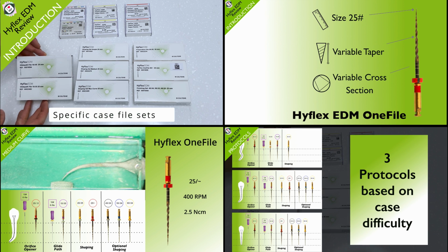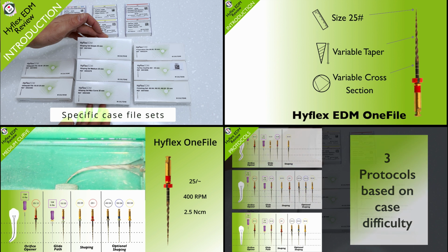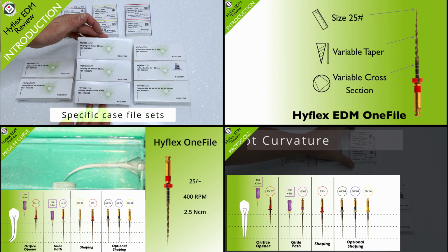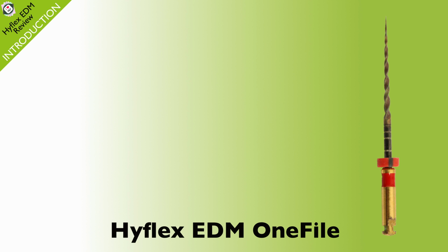Finally, as a bonus, I want to show you why I think this file system might be an ideal endodontic file to use when carrying out NHS treatments, mainly for cost effectiveness. So the file has a few specific characteristics.